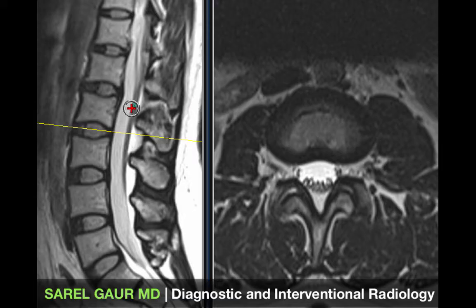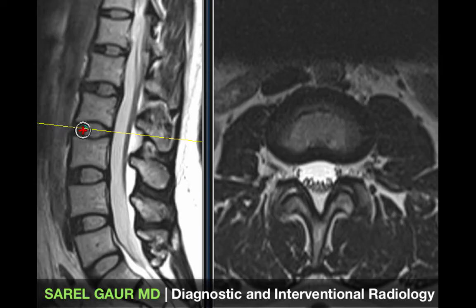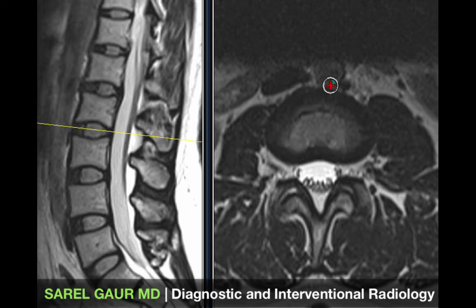Let's look at all this anatomy on the axial view to correlate it in a different plane. Cutting right through a disc, I can see it is round with low signal peripherally due to fibrous tissue, and centrally it has high signal due to higher water content — the nucleus pulposus.